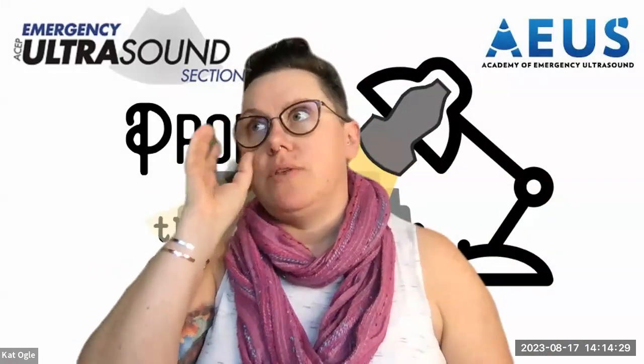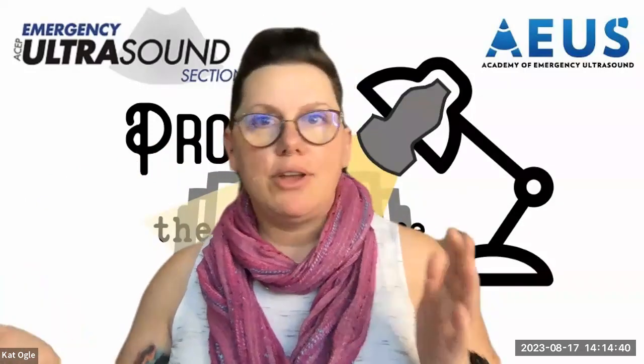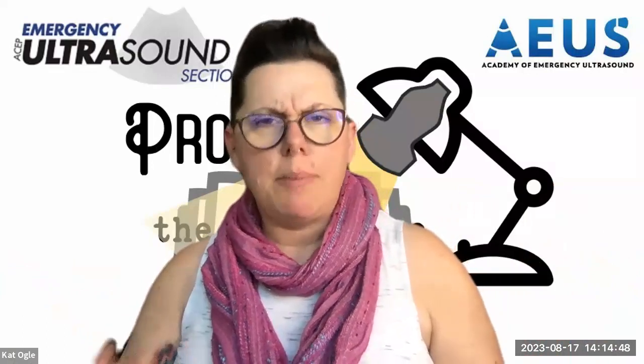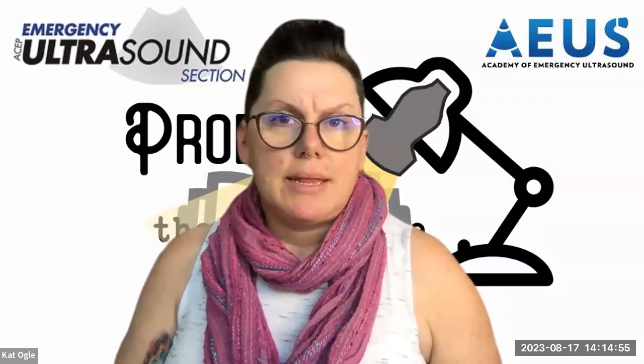And the other piece that we had actually hypothesized in the beginning was that we expected a lot of our false positives were going to be patients that had physiologic free fluid in their pelvis. Because how are you going to differentiate between physiologic free fluid in the pelvis versus traumatic free fluid in the pelvis? There were a couple of those cases, but that was not the vast majority of them. And there were a couple that I think we were not anticipating, and that was residents who identified the seminal vesicles actually as free fluid in the pelvis.